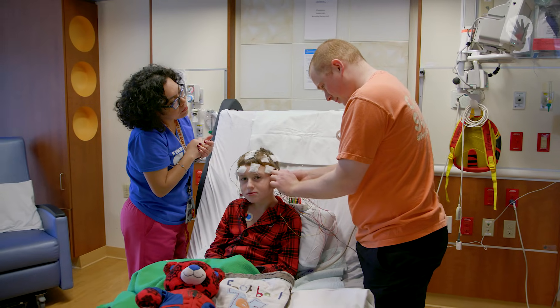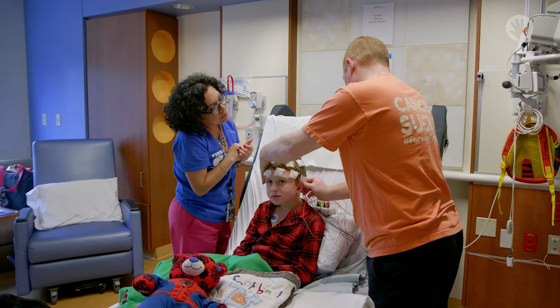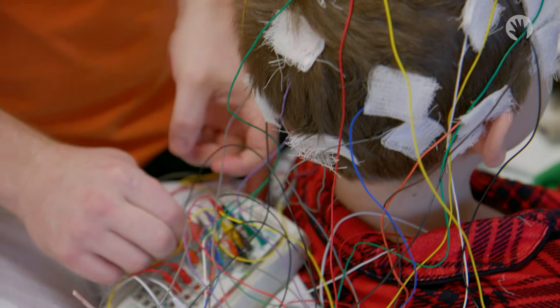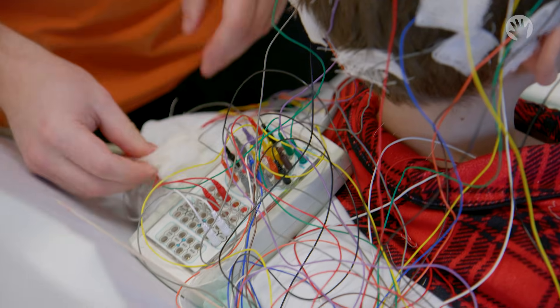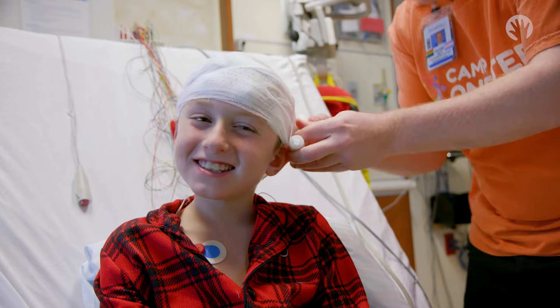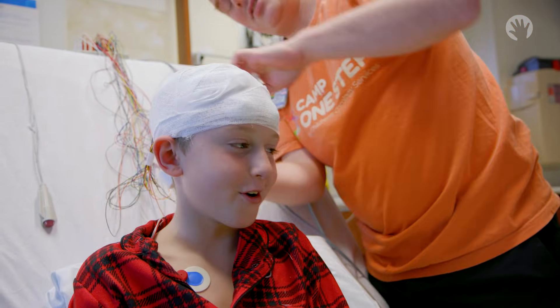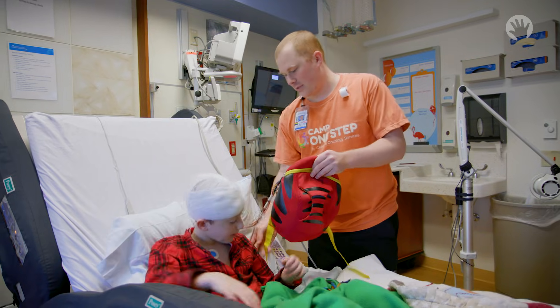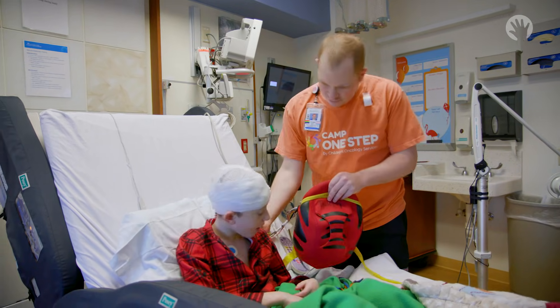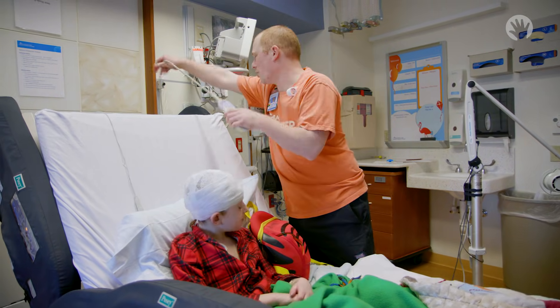Setting up the test usually takes about 45 minutes to an hour. That's usually the time where we get to know the patient a little bit better — find out when their last seizure was, what kind of things we're expecting when they have their seizure, how likely they are to have a seizure. These things really play an important part in making sure that the doctors have exactly what they need.